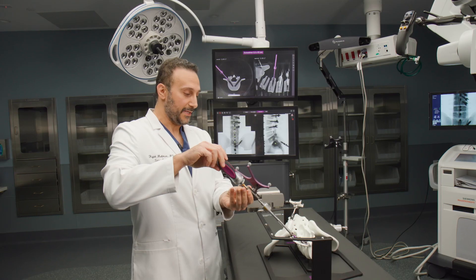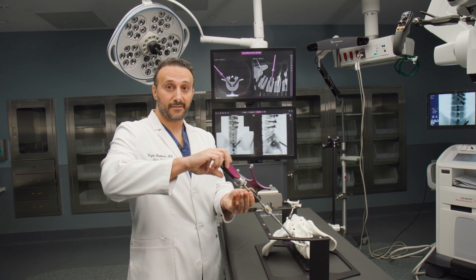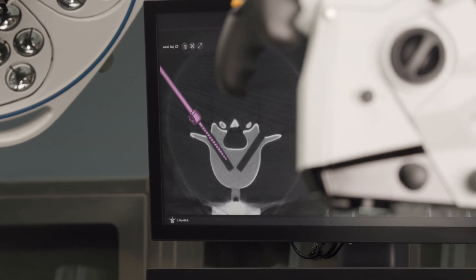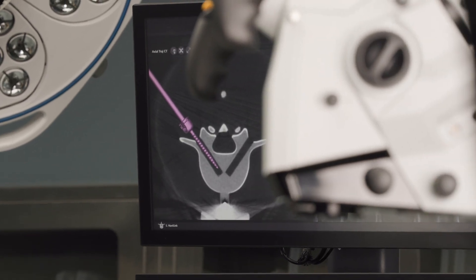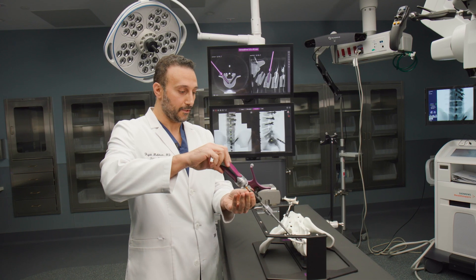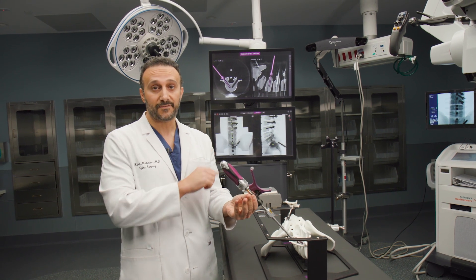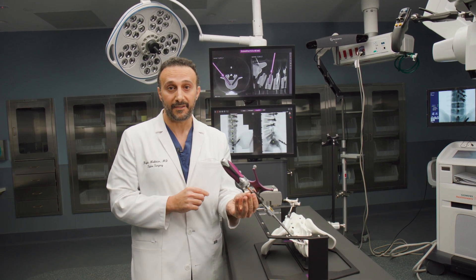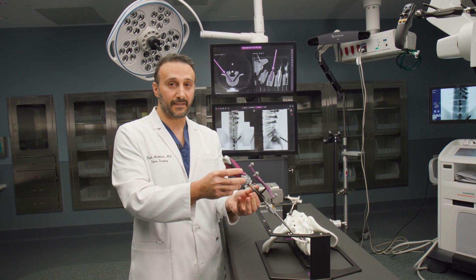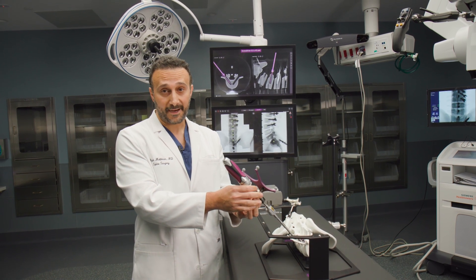As we advance the screw in, you can see on the screen behind me there, we can see exactly where that screw is going. There's no guessing or interpretation of x-ray images during the surgery — this gives us real-time feedback of exactly where it's going and allows the surgeon to place it very accurately.